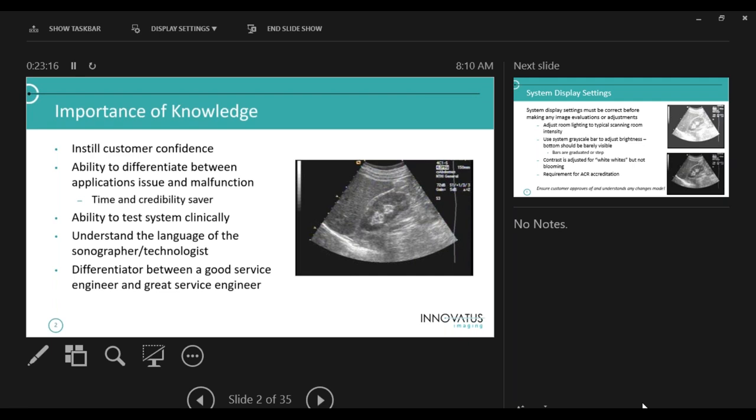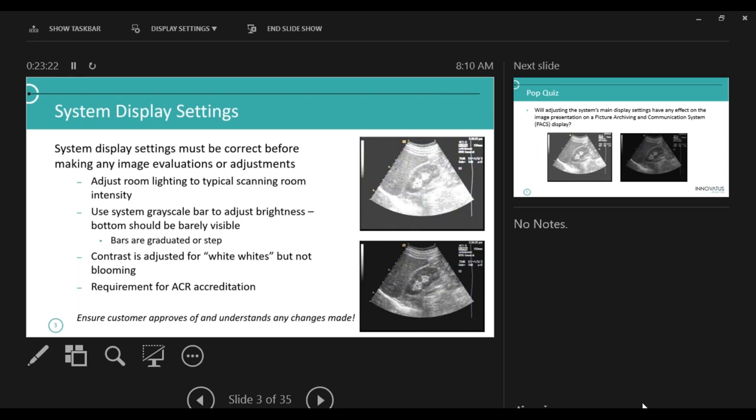Let's start with system display settings. I put two different display settings here — one is incorrect, one is obviously correct. Before you start looking at an image, you want to make sure your main display is adjusted correctly. If it's not, everything else falls apart. In the top image I made the background way too bright and the image way too high contrast. You can see this grayscale bar — the bottom step very discreetly fades into the background. The bottom image here is adjusted correctly. Before you adjust any settings on an ultrasound machine, talk to the sonographer, because some prefer their images adjusted a certain way.